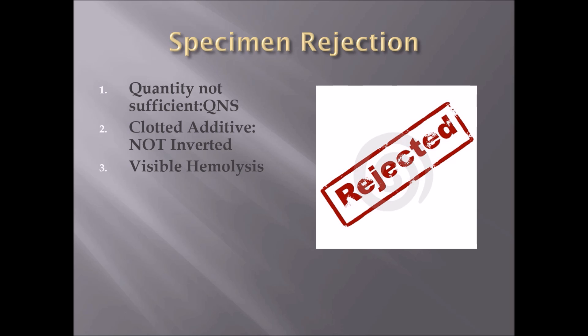Number three: visible hemolysis — the destruction of the red blood cells in the tube. This can happen if you shook the tube instead of inverting it. It can also happen during transportation from the lab to the facility being tested, so it may not be the phlebotomist's error. This is questionable on whether it's phlebotomist error or if it happened along the way to the lab.